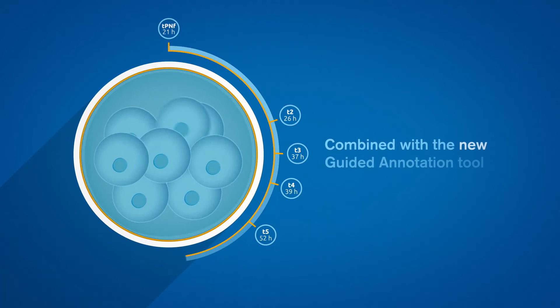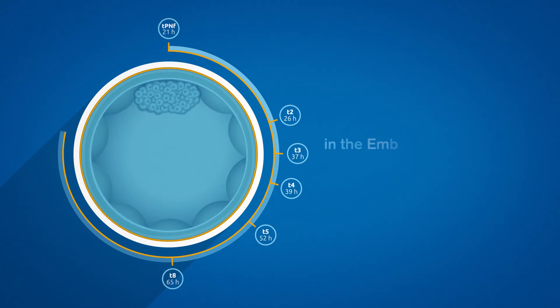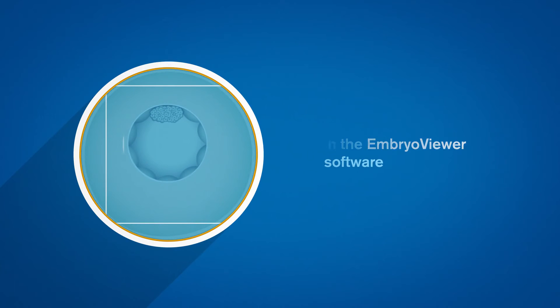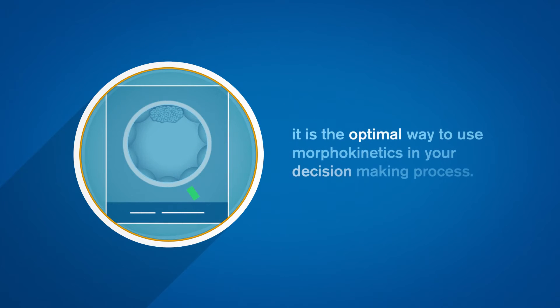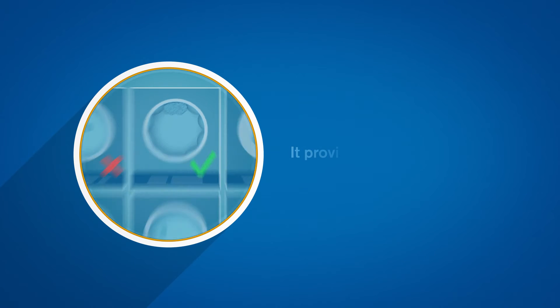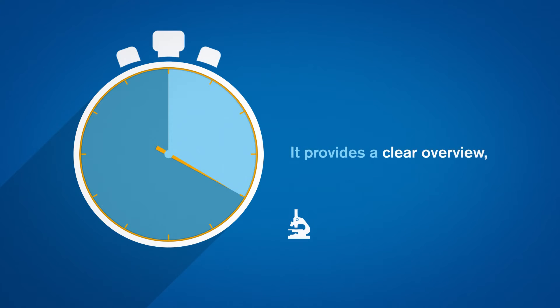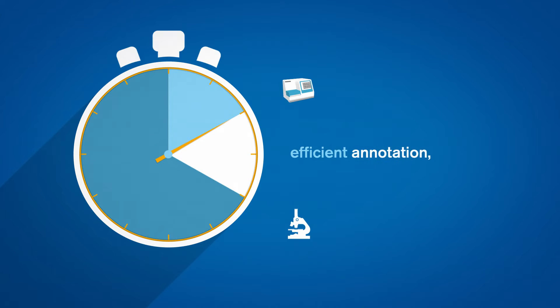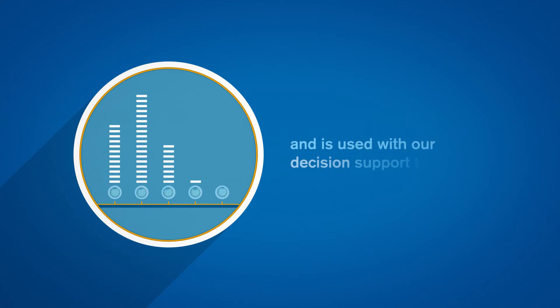Combined with the new guided annotation tool in the EmbryoViewer software, it is the optimal way to use morphokinetics in your decision-making process. It provides a clear overview, efficient annotation, and is used with our decision support tool.